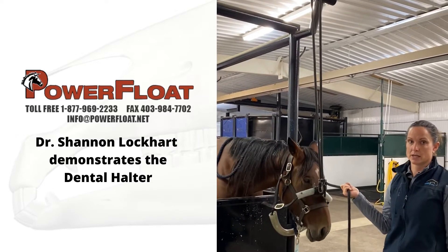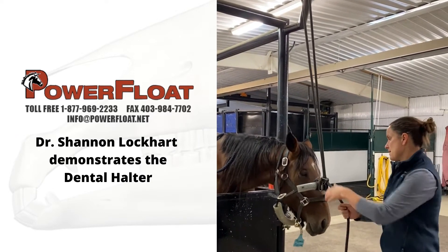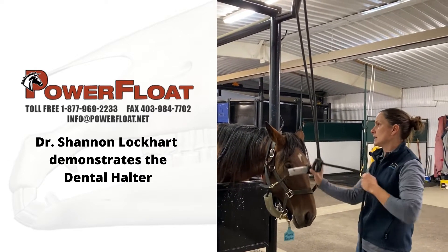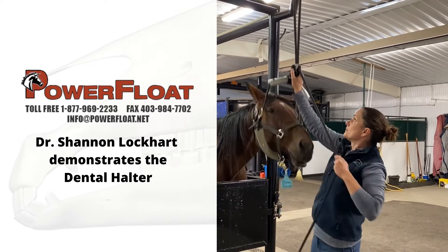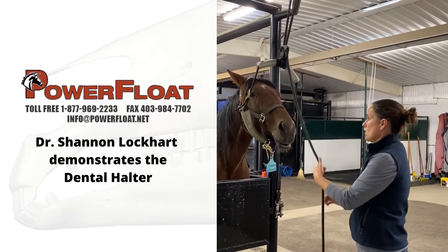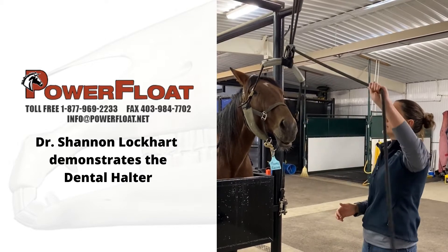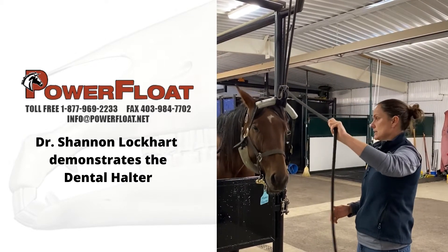It undoes as a quick release. So that's how I let the horse's head down when I'm done. All you do is pull the end of the rope towards you, it undoes the cleat, and you just let it down slowly.